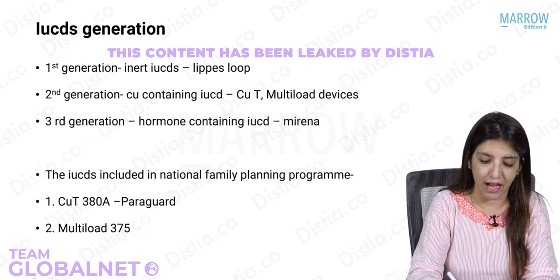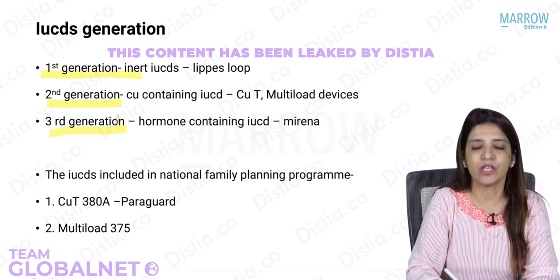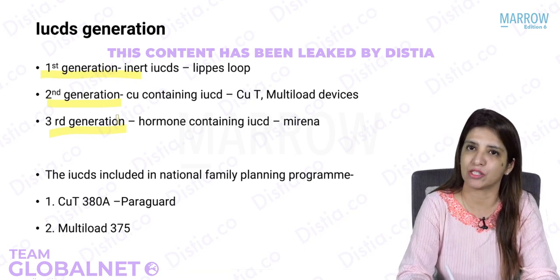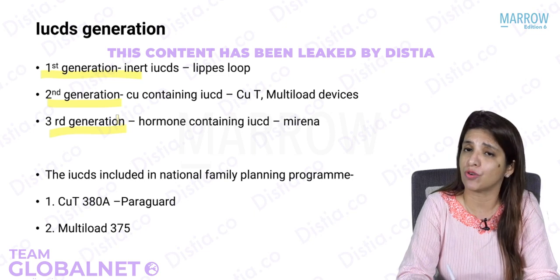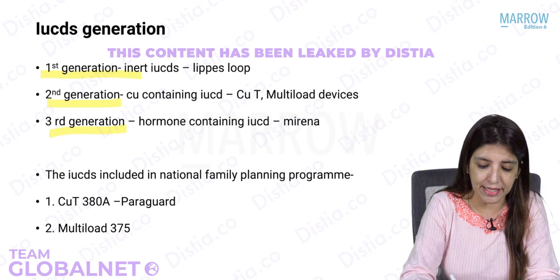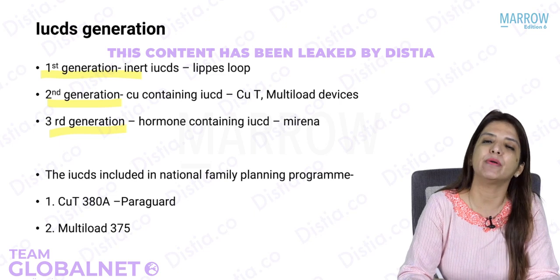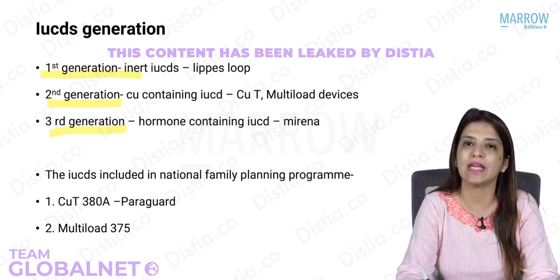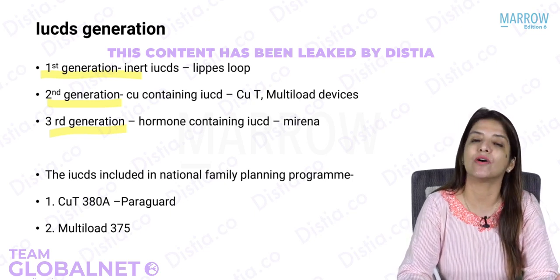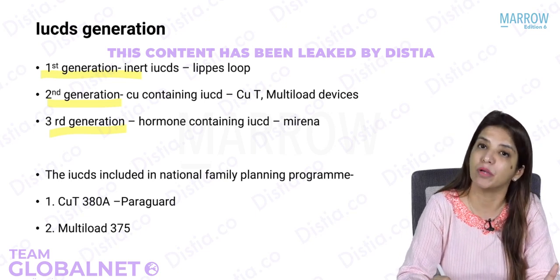Now IUCDs, they are 3-generation IUCDs: first generation, second generation and third generation. First generation IUCDs are inert IUCDs, and an example of first generation IUCD is a Lippes loop, and the first generation IUCDs are not being used these days. Then comes the second generation IUCDs. In second generation IUCDs, the important point is that they are all copper containing IUCDs. Example of second generation IUCD is copper T and multi-load devices. And then we have the third generation IUCDs, which is hormone containing, that is progesterone containing IUCD, and an example of that is Mirena. Right?